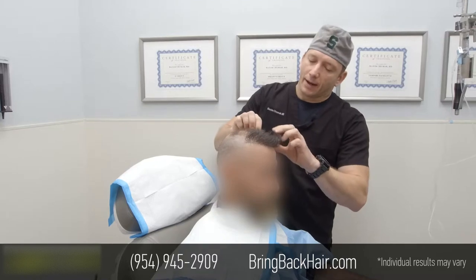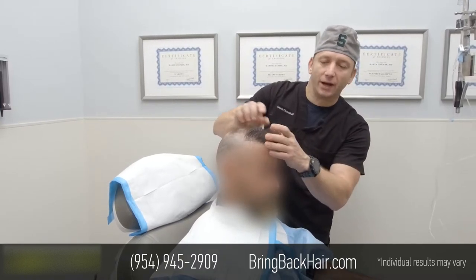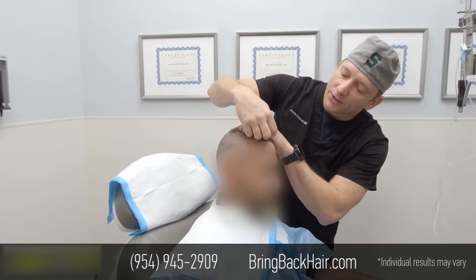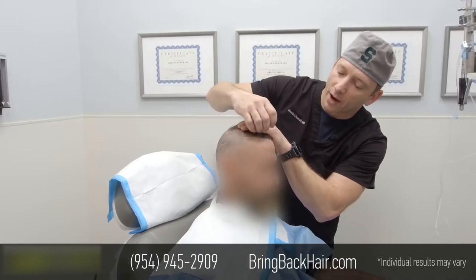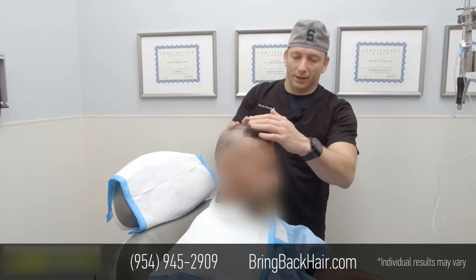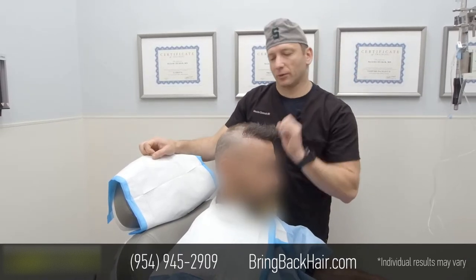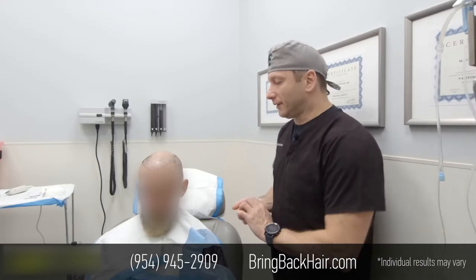I'm going to pretty much follow the same hairline as you can see here. I will just break it a little bit with smaller grafts and create a more natural hairline with some macro and micro irregularities.